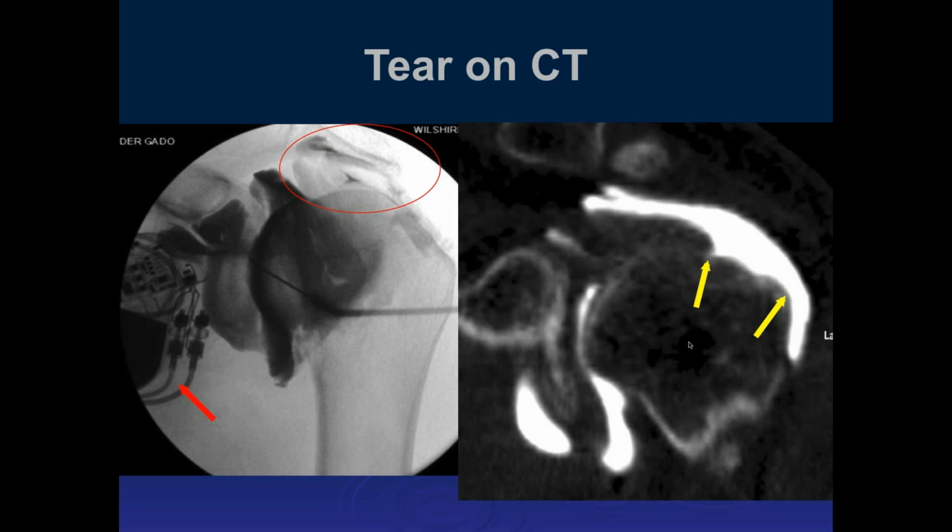Now, as a lot of you probably know, the current feeling is that all modern pacemakers can go in an MR scanner. So having a pacemaker, unless it's a really old one, and to be quite honest with you, even the really old ones probably aren't a problem in the scanner, as long as you have someone there who is able to monitor it, and if an arrhythmia occurs, be able to treat it.